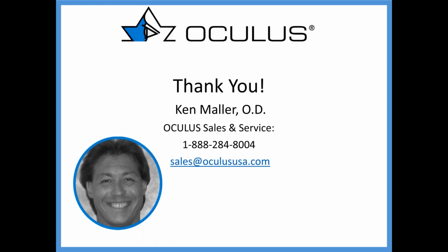Okay, I have 2 questions here that kind of go together, so I'll read them both to you, and maybe you can answer them separately or together. Sure. What do you consider a thin cornea since the front surface with orthokeratology has been altered? And can the Pentacam data show you whether Ortho-K is strictly epithelial or is there stromal change? Okay, to the first question, understand that the epithelial tissue centrally thins in Ortho-K.